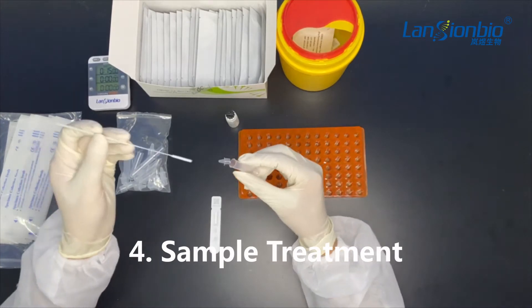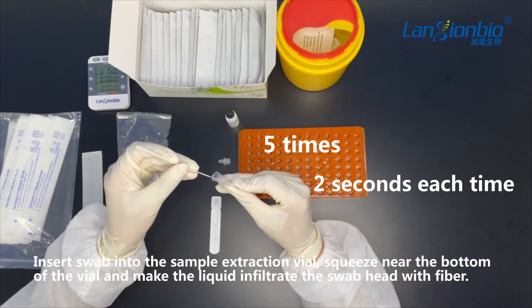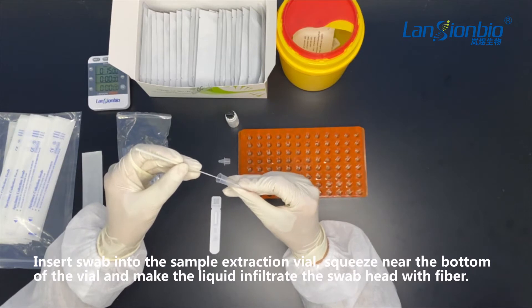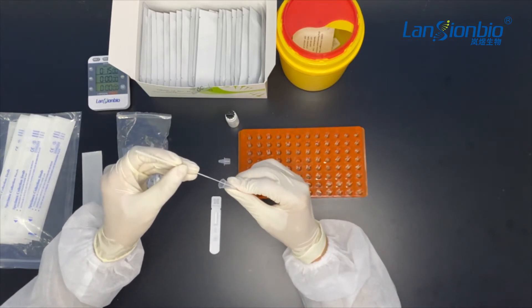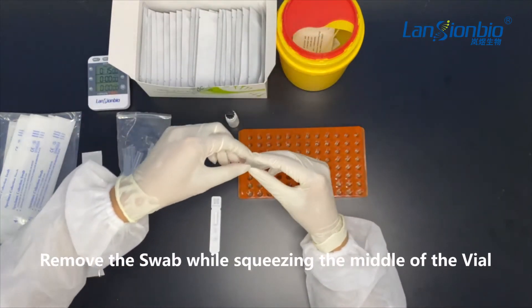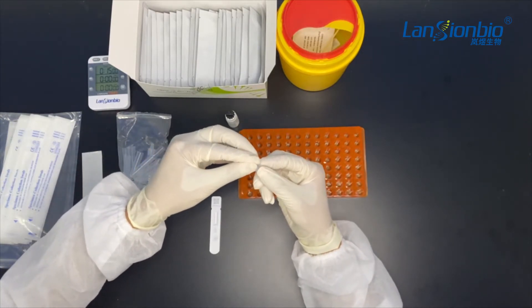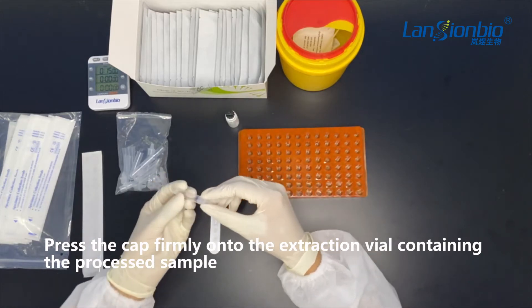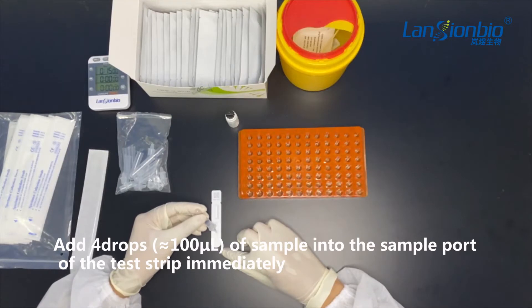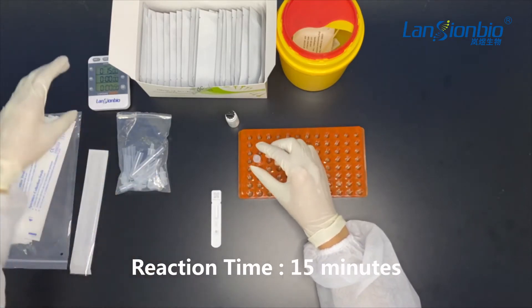The next step is sample treatment. Insert the swab into the sample extraction vial. Squeeze near the bottom of the vial five times, making the liquid infiltrate the swab head with fiber for two seconds each time to dissolve in the solution. Remove the swab while squeezing the middle of the vial to remove the liquid from the swab. Discard the swab in the biohazard waste bins. Press the cap firmly onto the extraction vial containing the processed sample. Add four drops — about 100 microliters of sample — into the sample port of the test strip immediately. The reaction time is 15 minutes.